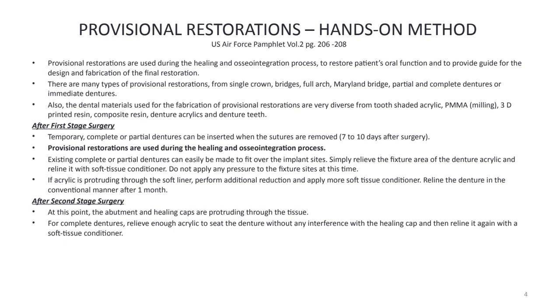In general, the provisional restorations are part of the pre-op, or before the surgery procedure. And this is done because when the patients are missing teeth or the natural teeth are extracted, we cannot send the patient home without any teeth.